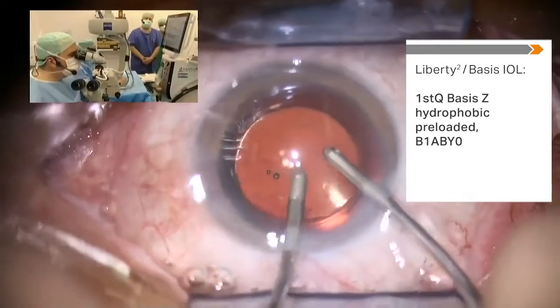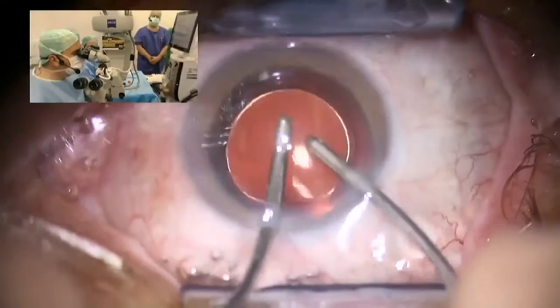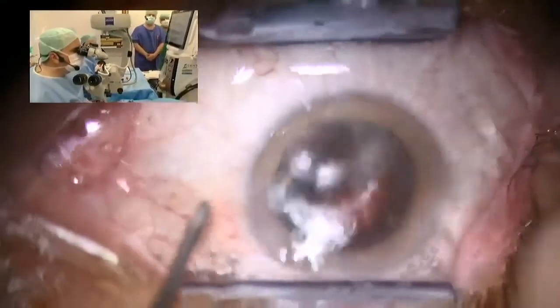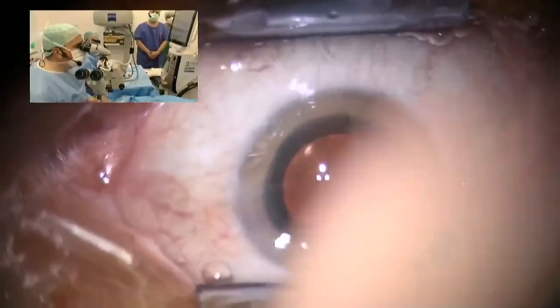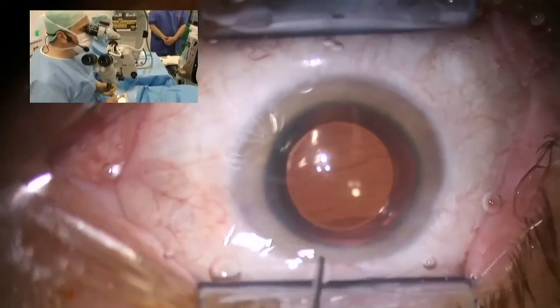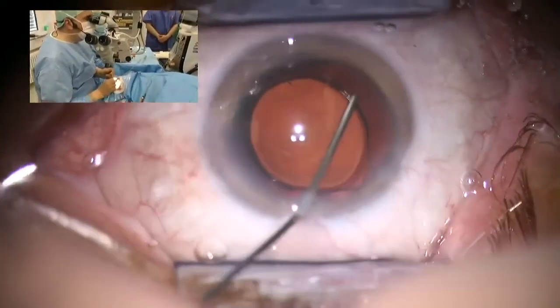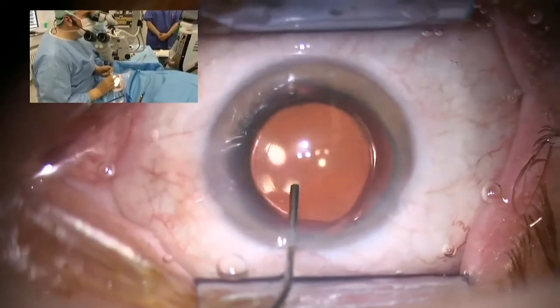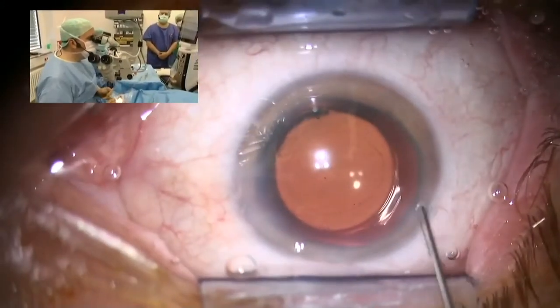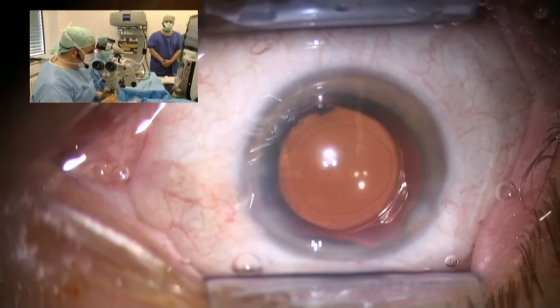We established two kinds of techniques. The one is in the softer cases, as you could see today, the bowling technique, where you circularly move inside the capsular bag to remove the nucleus and then the cortex. The other is a chopping technique, I normally use in, let's say, 95%. But it's different compared to a normal phaco.